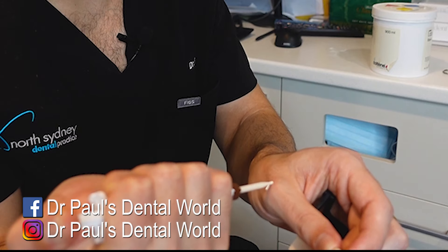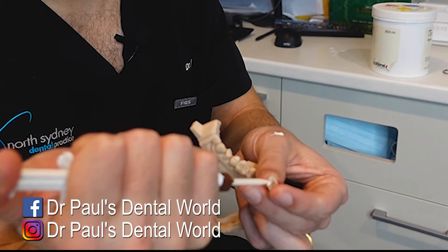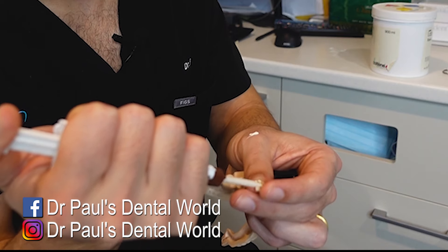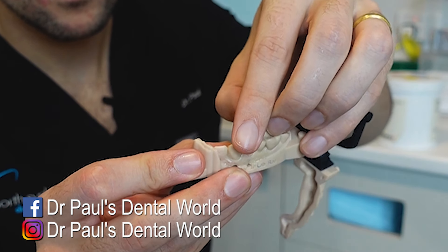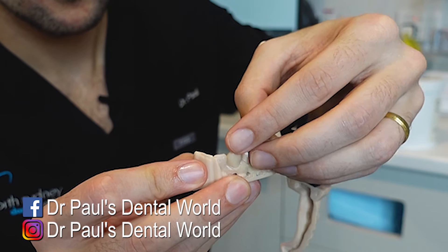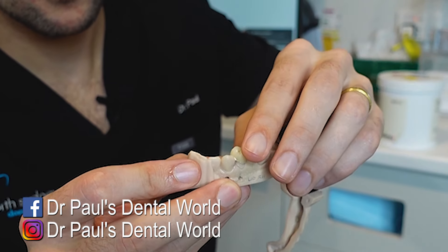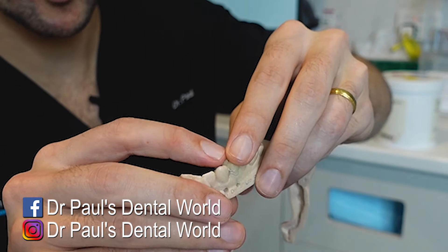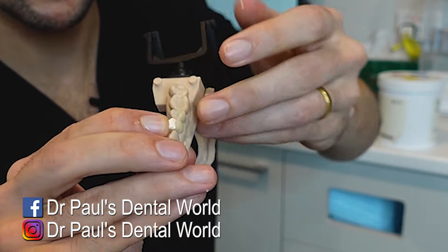First thing, bleed some of the temporary cement. Then place it inside here. You don't need a huge amount because we know that this is really well fitting. And then make sure it's around the right way. And make sure that your finger is not covering that vent hole. So I normally push down from the cusps and then push like that.